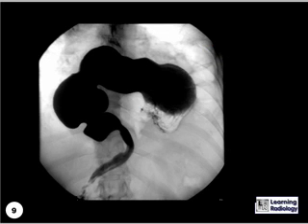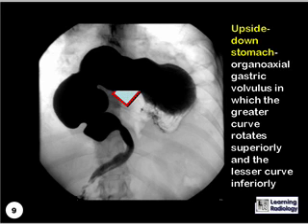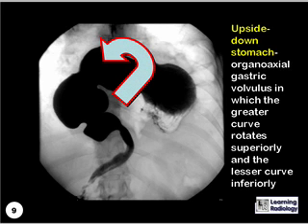What sign is seen here? This is the upside-down stomach, which represents organo-axial gastric volvulus, in which the greater curvature rotates superiorly and the lesser curvature inferiorly.